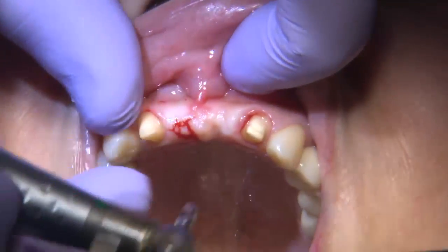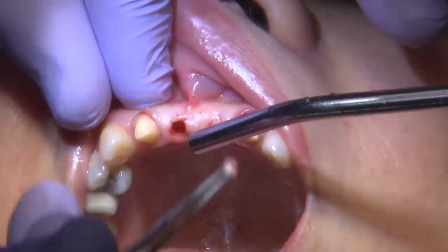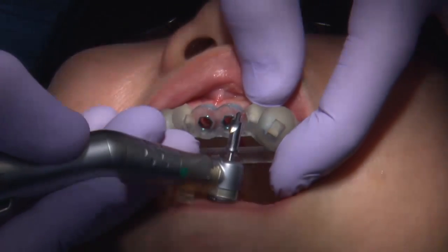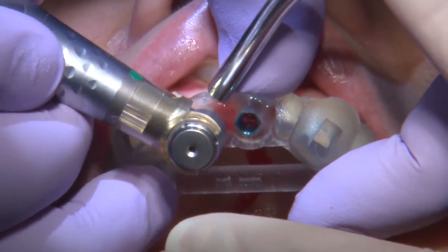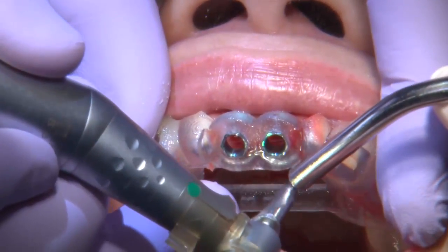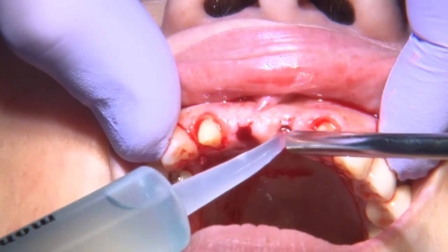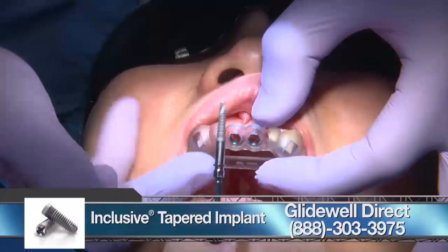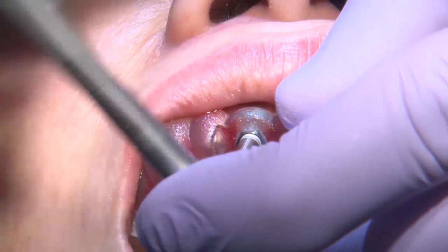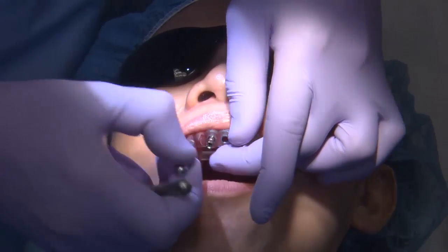We went through treatment planning, and I wanted to make sure I could place these implants mesiodistally, buccolingually, and at the correct angulation, ensuring that the screw channel is coming through the lingual so I can have nice screw-retained crowns for the end product. Going through with the guided surgery, I removed the soft tissue and utilized osteotomy drills until the last osteotomy drill matched the size of the implant. I then placed the implant through the sleeve of the surgical guide — a tooth-supported surgical guide — so the patient received implants in the precise planned location.